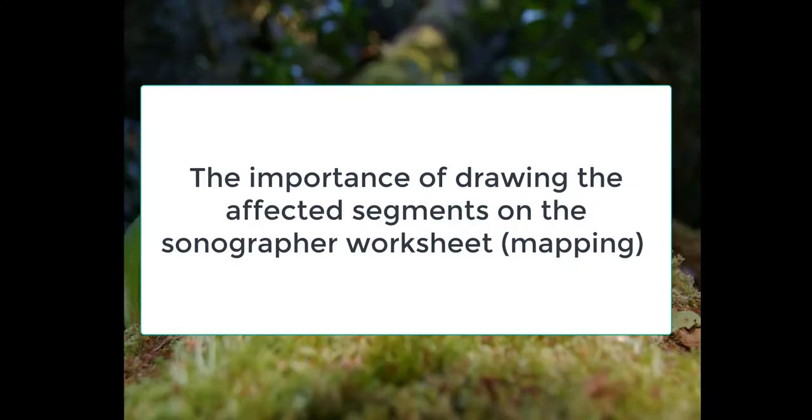When we were doing them in the beginning, they would send the patient back and say, we want you to put a little line along the line of the artery where you think it's thickest so that we can biopsy. So I think that is pretty important. Just from what I was saying about the skip lesions as well, they can just blindly go in and biopsy it, but they mightn't actually keep the bit of the artery that's affected.